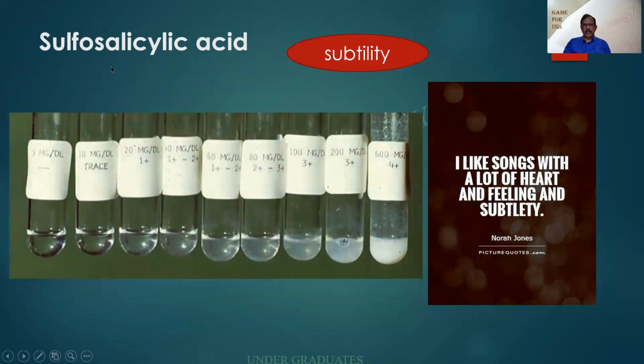Look at this one over here, sulfosalicylic acid. I hope you people are able to identify where the precipitate starts and where it ends. Ending is obvious, but then where it starts, you people can make out by yourself. Look at this one, trace, 1 plus, and so on till 4 plus. The grading, I would like you people to answer. Definitely, I will ask you in the exam.